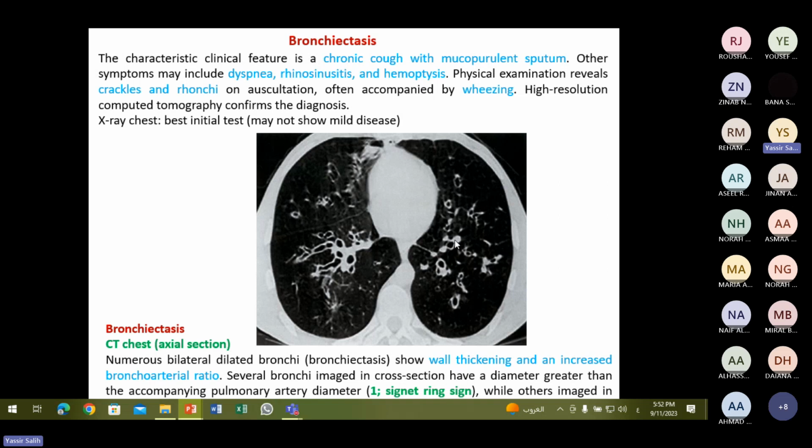فدي بيسموها increase broncho-arterial ratio اللي هي حصل لنا thickening of the wall of the bronchi فأهم حاجة تعرف إنه this is بيسموها signet ring sign يعني كأنه الخاتم ده موجود عليه شيء في الطرف كده زي الماظة وبيسموها signet ring sign فكأنه ده الخاتم وجنبه هي زي الماظة. فإذا دي يسموها signet ring sign مهمة جدا this is signet ring sign. طيب أحيانا بنشوف in the chest X-ray أو in the CT إذا عملنا مثلا coronal أو in the chest X-ray بنلقى حاجة اسمها tram track sign تلقى إنه كأنك الطريق بتاع train.